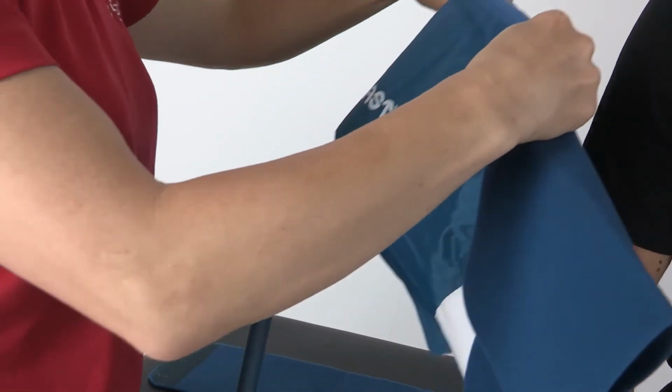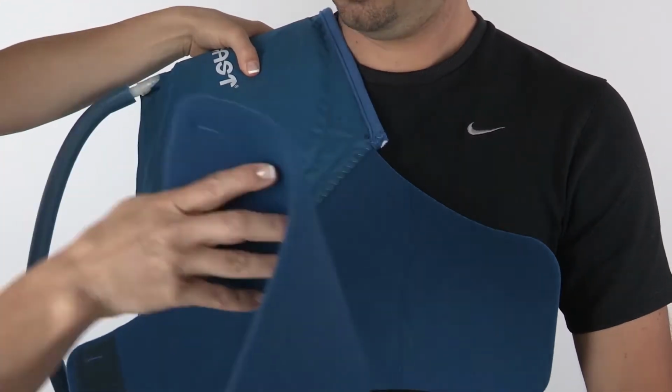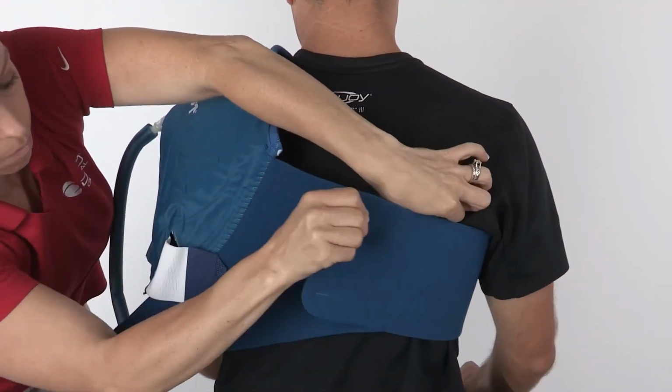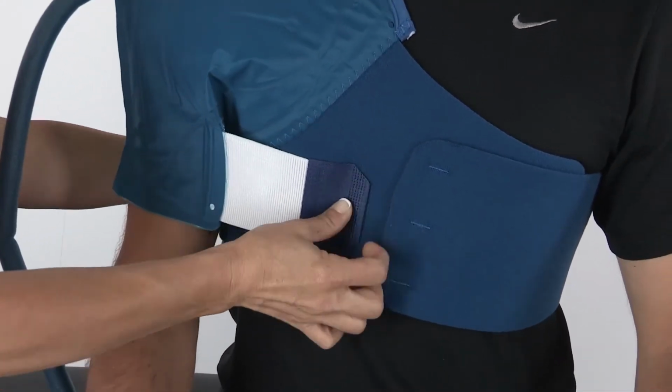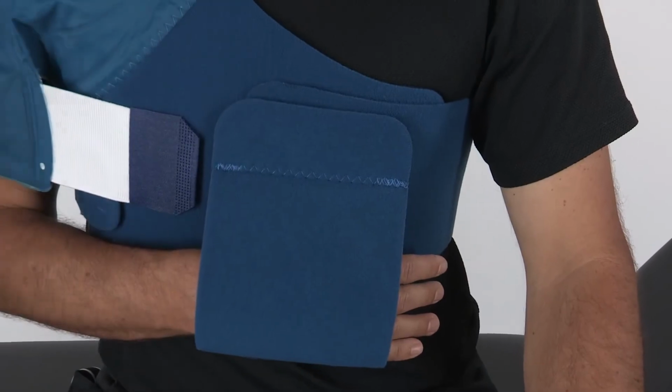Shoulder application. 1. Make sure your cuff is empty prior to application. 2. Apply the cuff, attach the straps around the torso, and secure in the front and the back. 3. Secure the strap on the side of the affected shoulder, front and back. These straps can be opened as needed to do shoulder exercises.